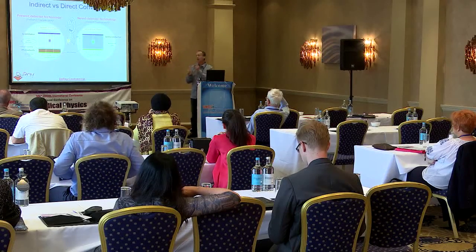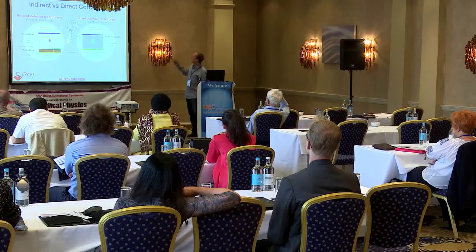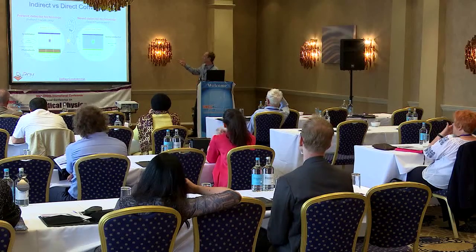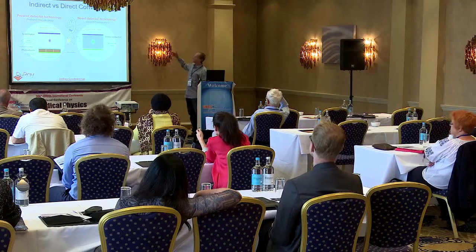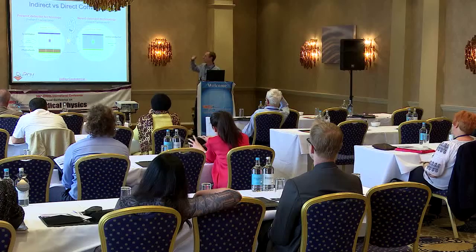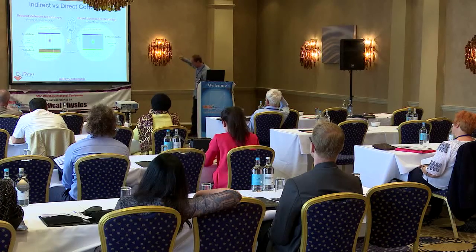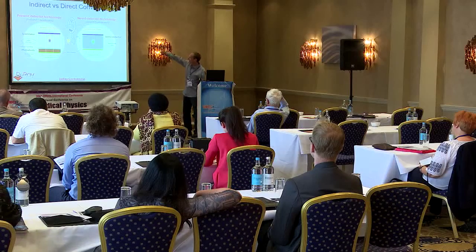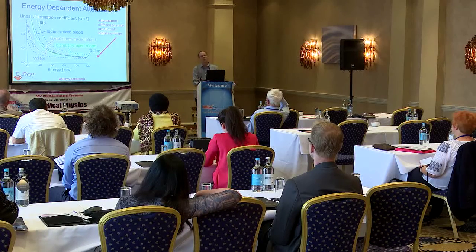The novel detector technologies I would like to use to replace these systems count individual X-rays and are able to bin them according to energy. This is done in direct conversion semiconductors, which convert photons into electron hole pairs, which are then collected across an electric field bias. And there's many reasons why this is of value.